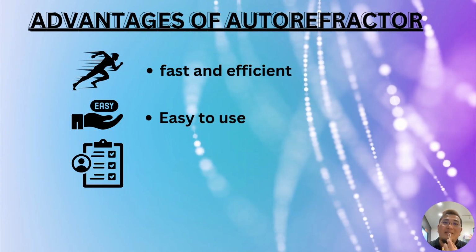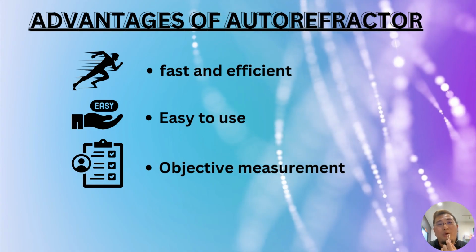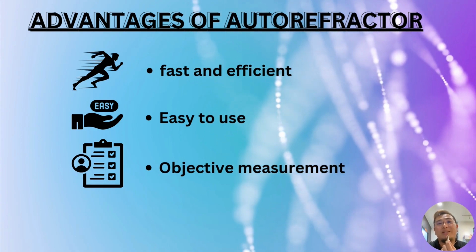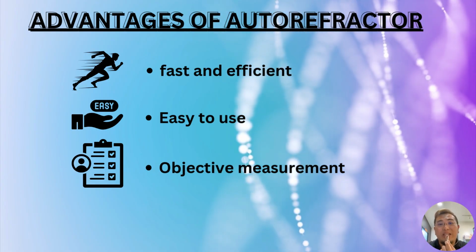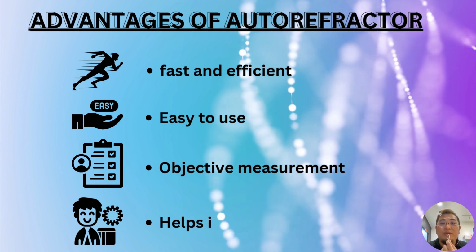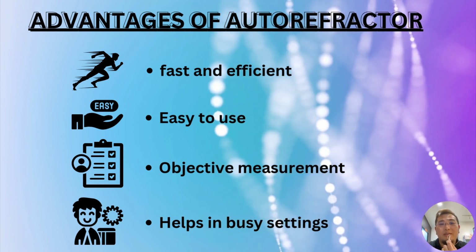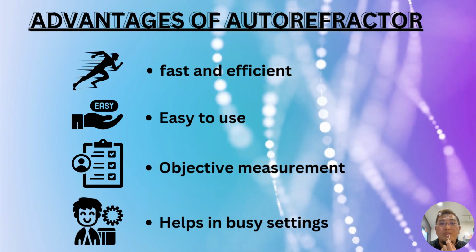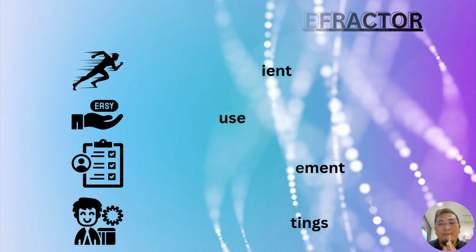Since it doesn't rely on the patient's response, the autorefractor provides an objective and consistent reading, a reliable starting point before performing subjective refraction. So the autorefractor is useful in high volume settings such as clinics, hospitals, and community outreach. It saves time and increases the patient flow efficiency.